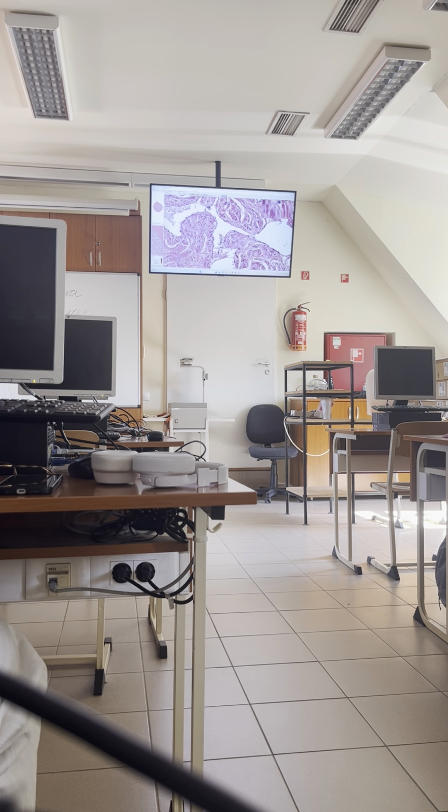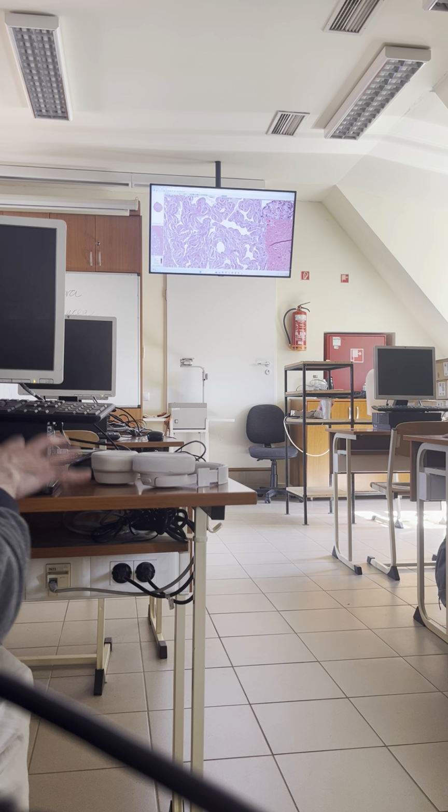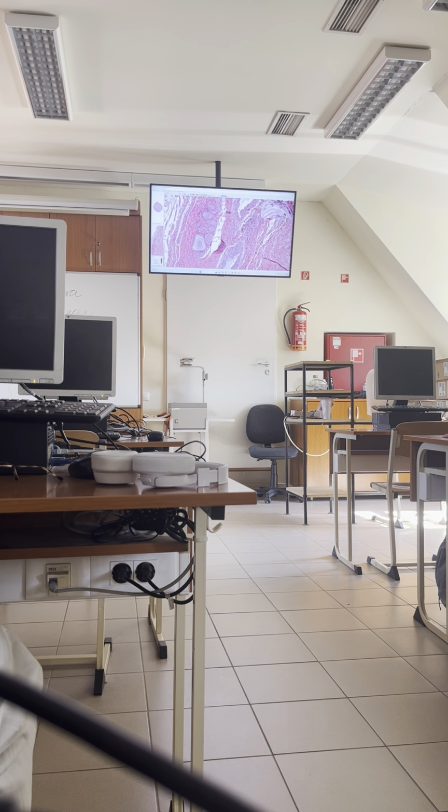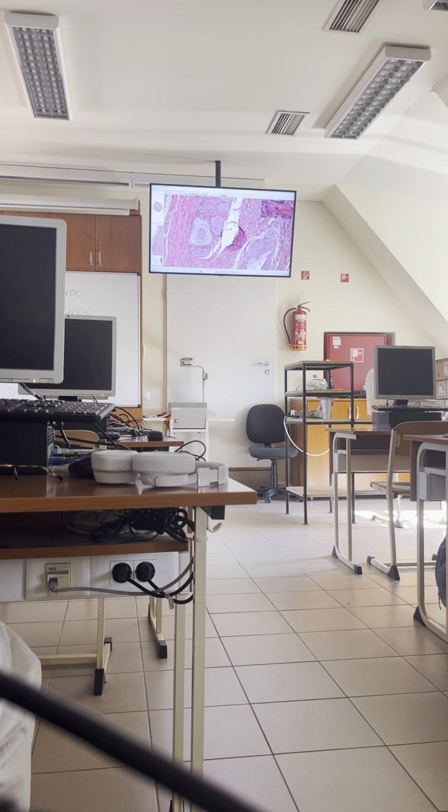Okay, so this is another aspect of the story. And here in the adult penis, I can show you something else, like this. Can you recognize? Yes, this is a Pacinian corpuscle, which is a mechanoreceptor.